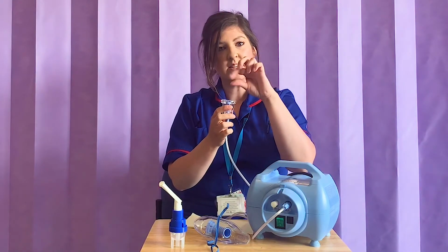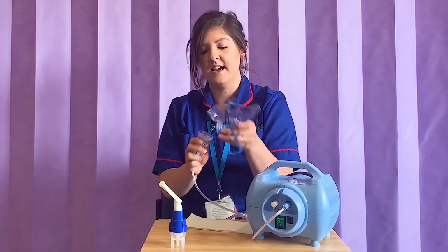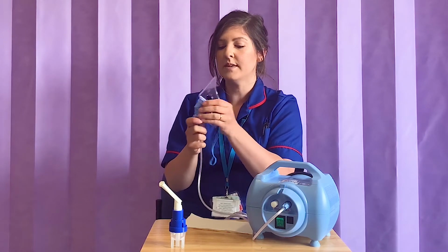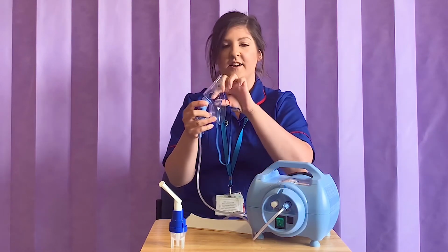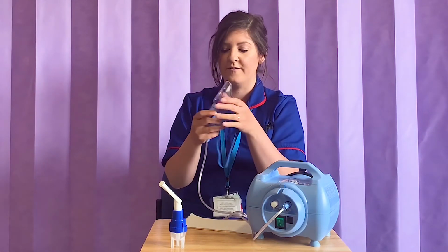This is where you will squeeze in your nebules, and then you can attach either a mask or a mouthpiece, depending on what you find more comfortable. The mask needs to sit comfortably over your nose and mouth and is secured with a piece of elastic. You can then adjust the tightness at the front to make sure you've got a good snug fit.